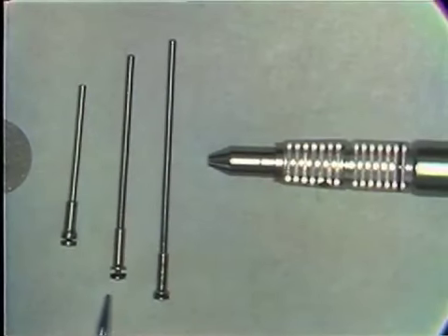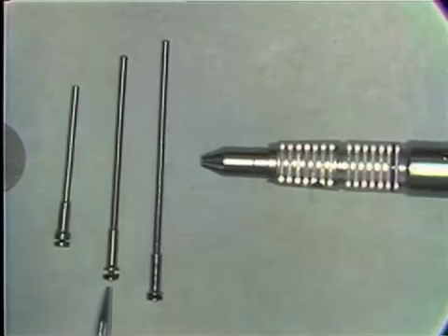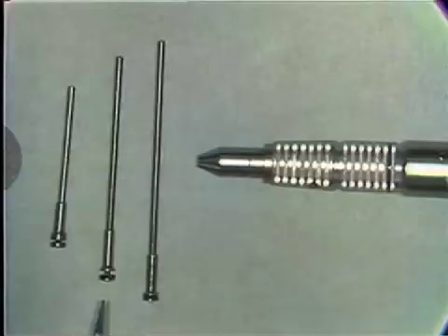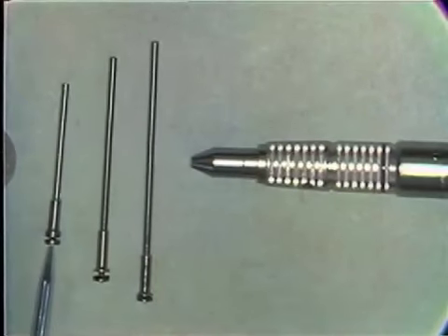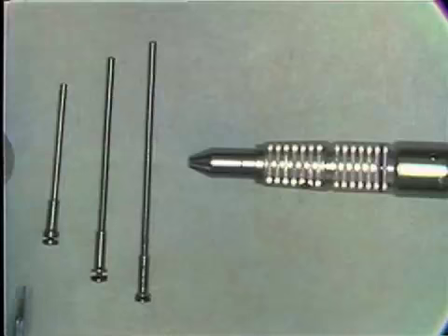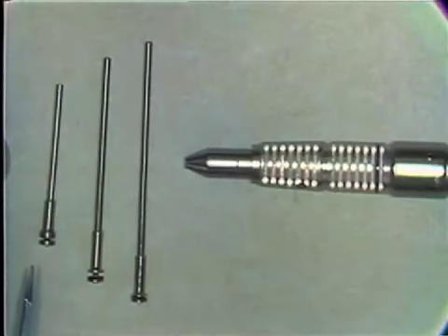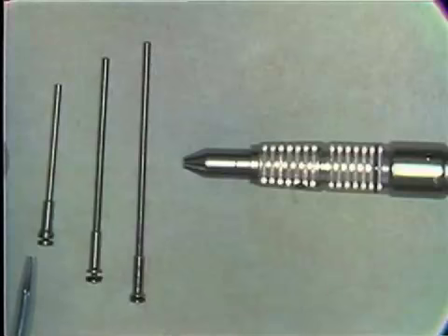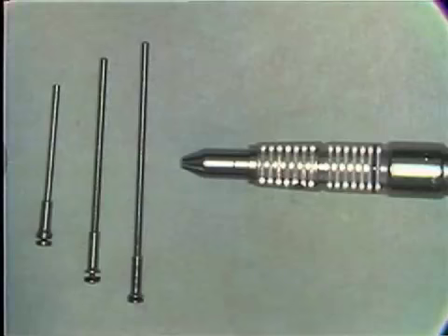This allows us, as we will show later on, to get above the occlusal surfaces of the teeth without putting too much taper on the tooth itself. If we use a small, short mandrel, it is necessary then to use a large disc. And this is one of the things that we're trying to get away from in this modified slice preparation. Now I would like to go to a patient and show you the positions that we will use in slicing the different quadrants.